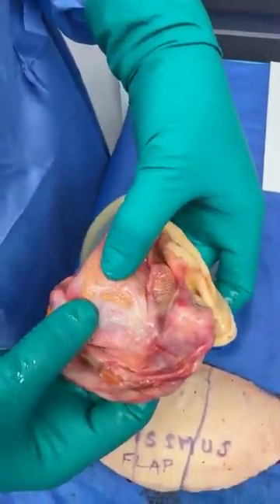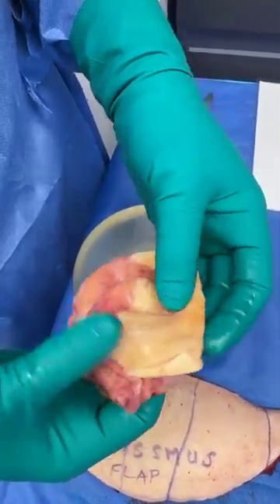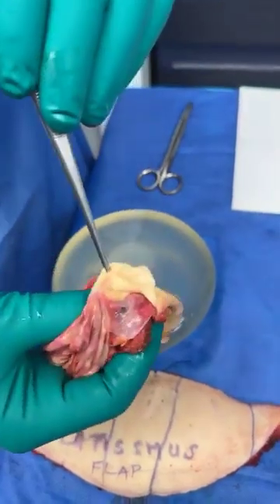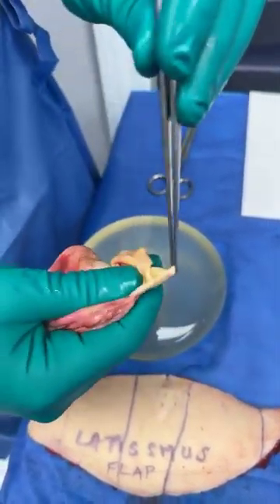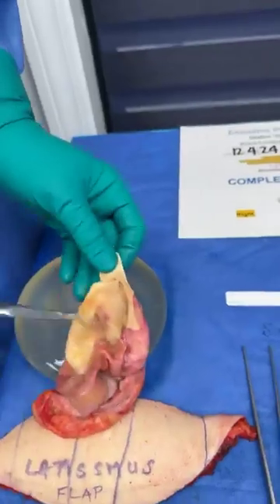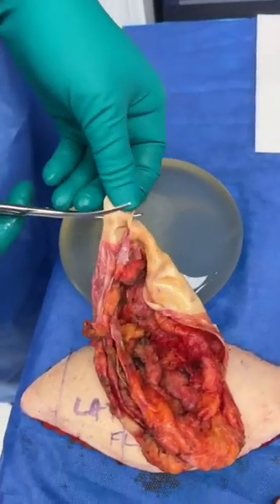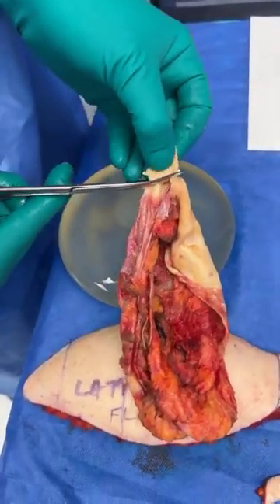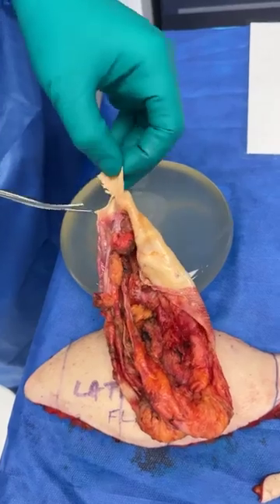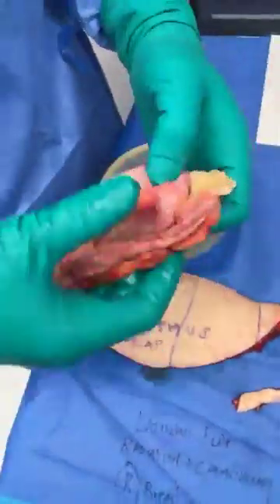And look at these streaks. This is apparently another mesh that was used. And look at this cadaveric skin, the alloderm, biologic matrix that was folded up on itself. It's very hard. Let me show you. This is, remember, cadaveric skin from another patient that's been processed so that the body does not reject it. If I try to cut it, I cannot. So I have to come close, and you can see now I can cut it. If I take my scissors, you can see how thick this is. And this is the scaffold, the reinforcement that's used.